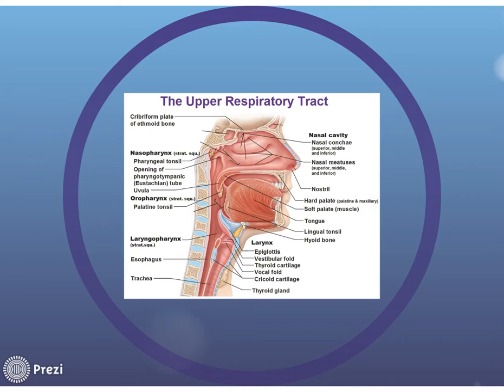I don't have a picture with the blood vessels there. But basically the main blood vessels, the big ones, are going this way, right? Yeah. I was thinking that because you always cut away from your finger whenever you do scalpel cutting. That's why I was thinking, oh, the YouTube showed it going up first. I mean, of course the spread is horizontal, but whether it's up or down, that doesn't matter.